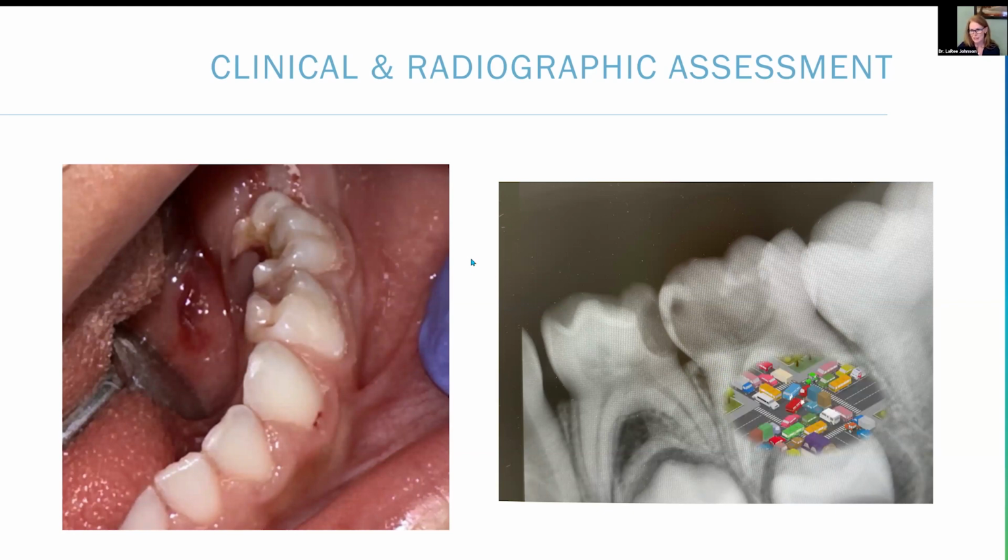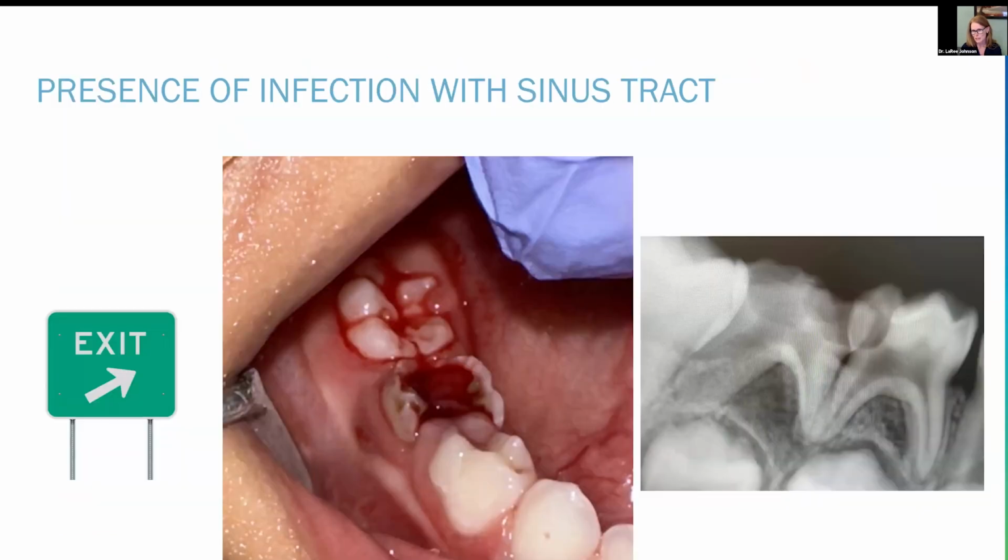All right, other things. We consider an infection basically a traffic jam. If you think about the Haversian and Volkmann canals as this interstate system, and you put an infection there, you just clogged it with an accident, especially if there's loss of bone. You can't travel through a bony space where there isn't bone. So in this situation, I would give multiple injections because there's deep caries on the tooth mesial, just to ensure we have everything taken care of.